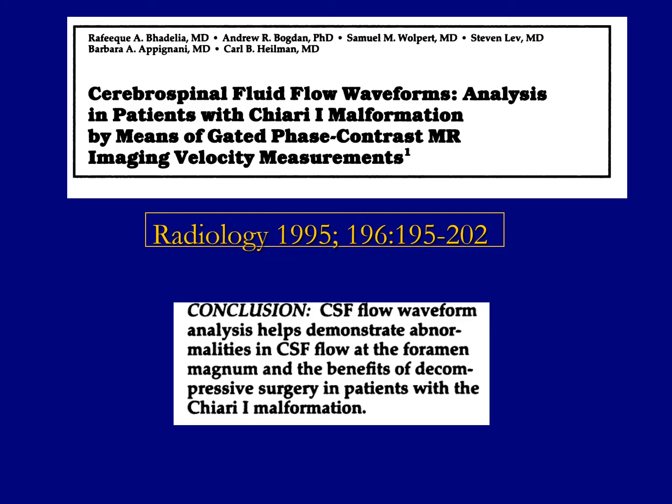I have been working on imaging the CSF flow in Chiari patients for quite some time. As you can see here, this is our first publication in 1995 in Radiology, which dealt with cerebrospinal fluid flow waveform analysis in patients with Chiari malformation by means of gated phase contrast MR imaging velocity measurements. At that time, we showed how it could help demonstrate abnormalities of the CSF flow and differentiate Chiari patients from normals, and also show how the benefits of decompressive surgeries can be assessed using the CSF flow.